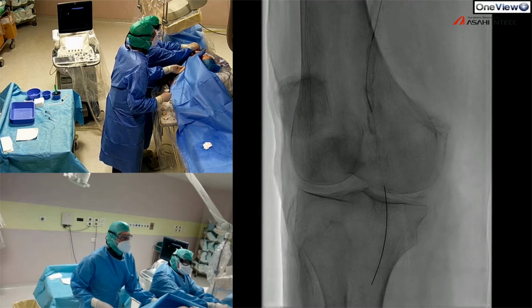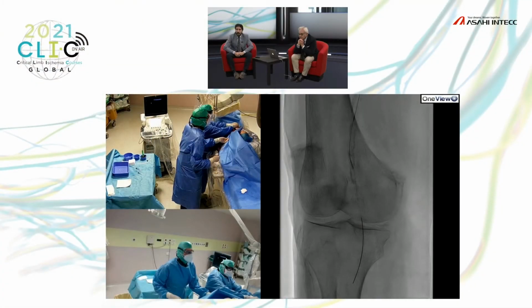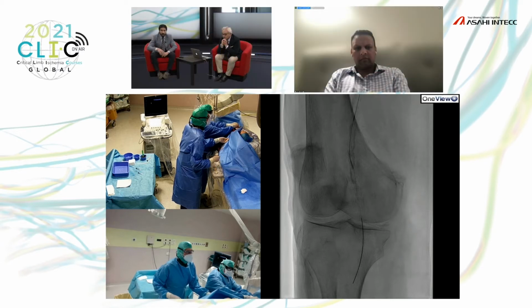I have a comment and a question for you. The first comment is that it was clear, as almost always happens, to penetrate the proximal cap. But the nice thing of this guide wire, following the video, was that the time you enter the proximal cap, it was very difficult to go out. I mean, the guide wire navigates even when you push it. It follows, not always in the middle, because probably it finds a microchannel that was not always in the middle of the occlusion, but it was in the lumen. I think it was almost clear it was in the lumen, or finally re-entered suddenly.